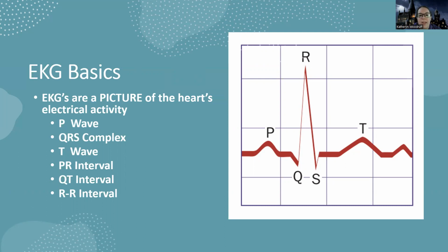So there's going to be different parts, and I have a slide for each part. I also have this cool little drawing tool, I finally figured out how to draw without having to X out of my PowerPoint while I'm doing it. So we have our P wave here, which is this hill before.